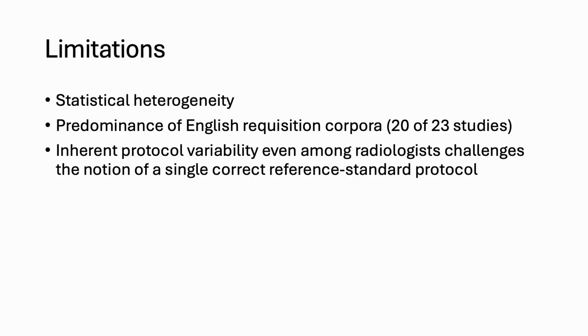In terms of study limitations, there was significant statistical heterogeneity. There was a predominance of English requisition corpora, and there was also inherent protocol variability even among radiologists, which challenges the notion of a single correct reference protocol.